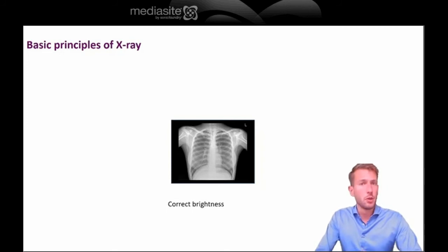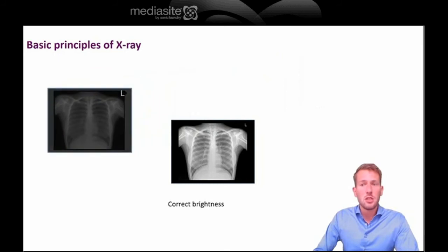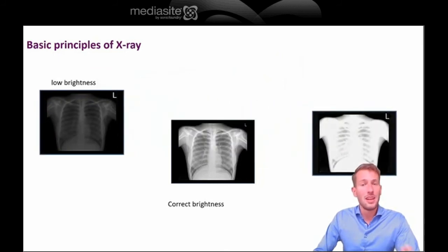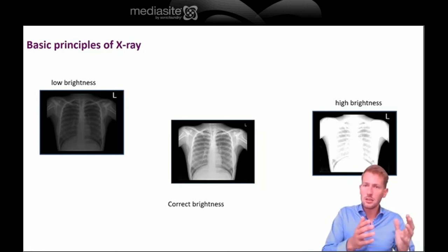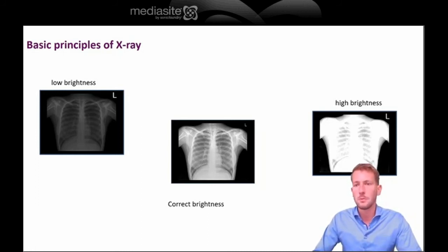In radiology, but also images in general, we can define multiple properties to assess or evaluate an image. One of them is brightness. It refers to the overall lightness or darkness in an image. Here you are given two examples where there's either too much or too little overall lightness or brightness. It results in a suboptimal contrast because either the extreme white or the extreme dark colors are not used.